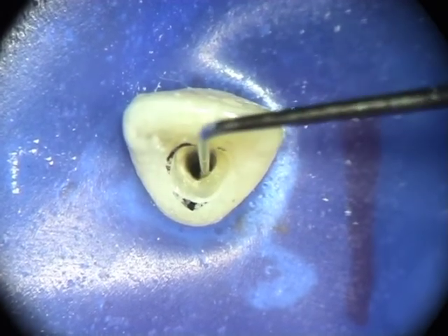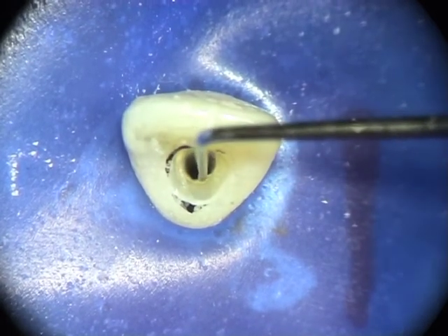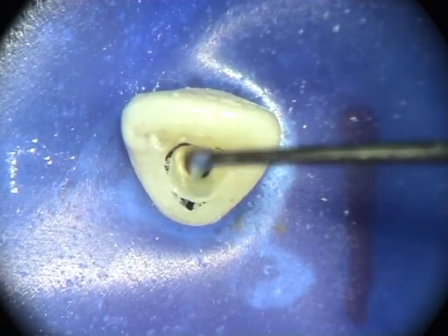When the access cavity is probed, it should be a smooth funnel from the surface of the tooth into the depths of the root canal.